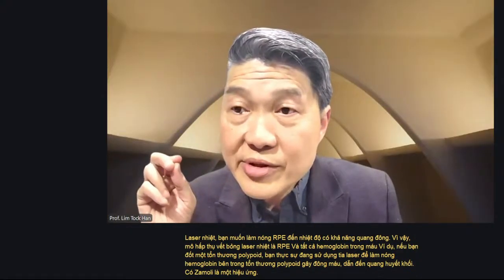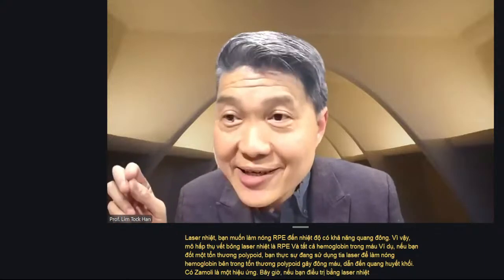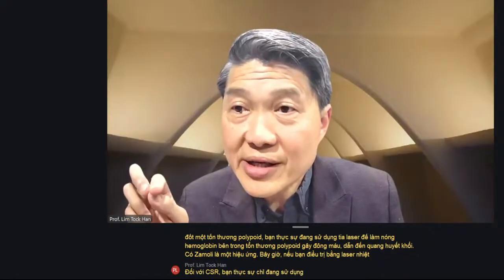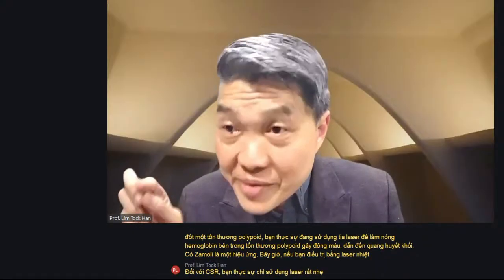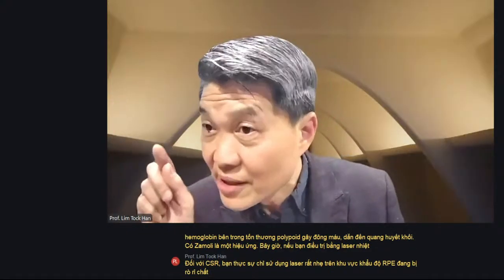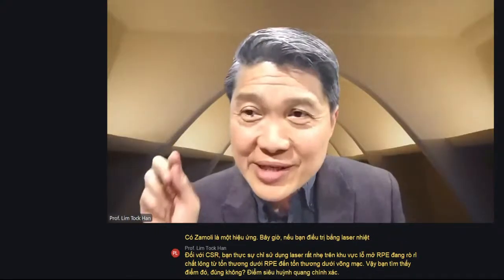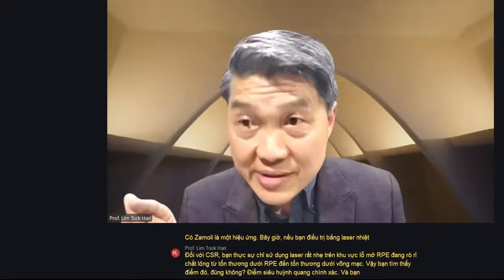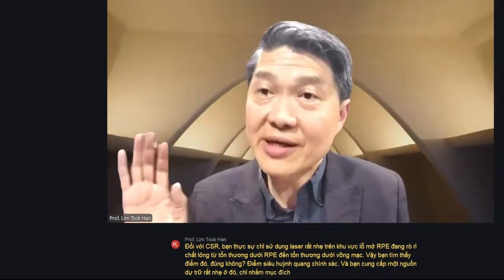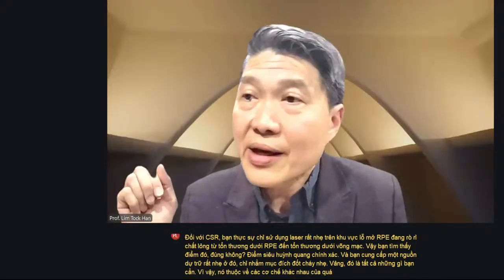Now, if you treat with thermal laser for CSR, you are actually just using very light laser on the area of RPE aperture that is leaking fluid from the sub-RPE lesion to the subretinal space. So you find that spot, the pinpoint hyperfluorescent spot, and you deliver a very light laser there, just aiming for a light burn. Yeah, that's all you need. So that is the different mechanism of action.